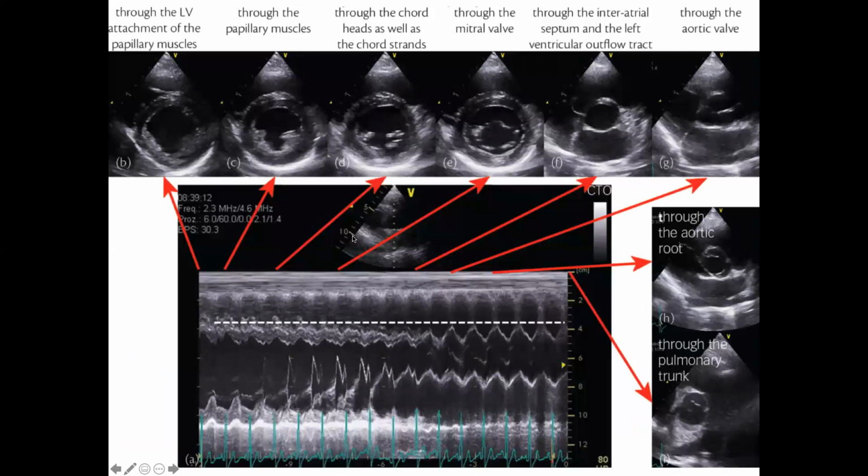So we can look at an example of some of these M mode pictures. So up here, these are two-dimensional. They're single time frames from two-dimensional images obtained with a transducer that's sweeping back and forth to make the two-dimensional pictures, okay? And so you're getting these images at, I don't know, probably 30 frames a second or 15. Just to orient you, this is the left ventricle, okay?